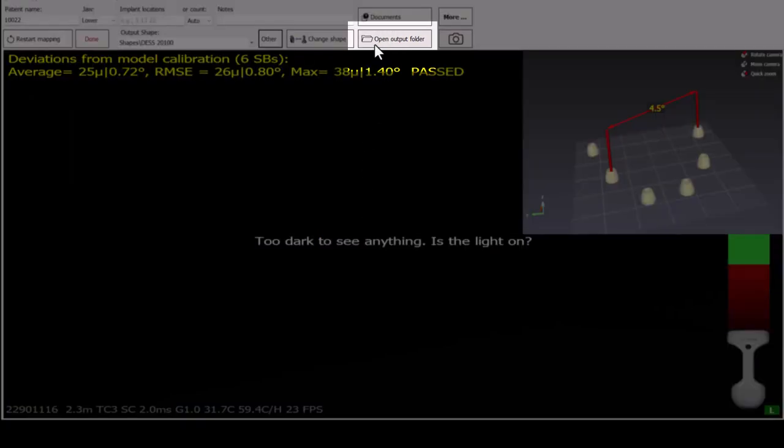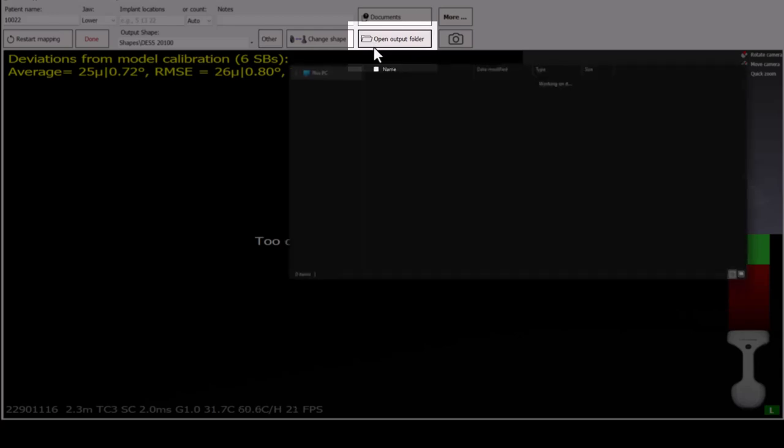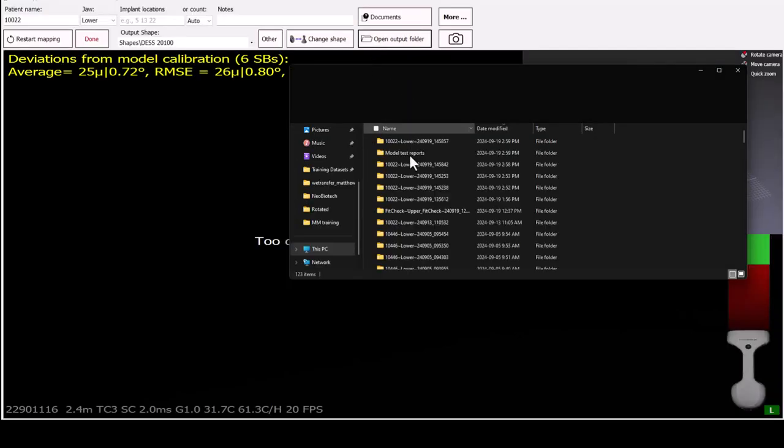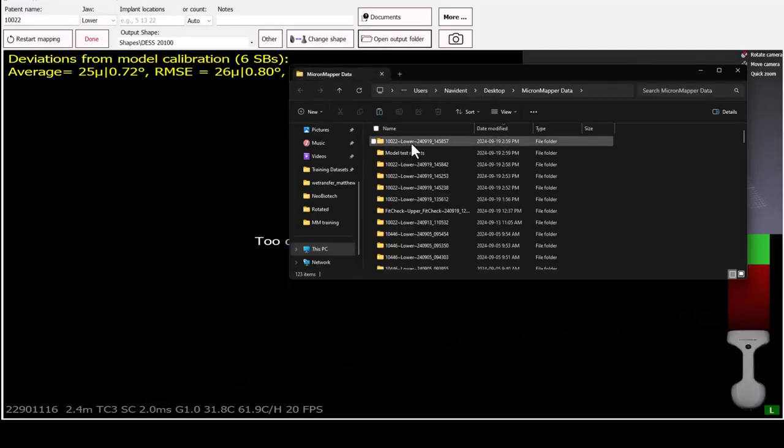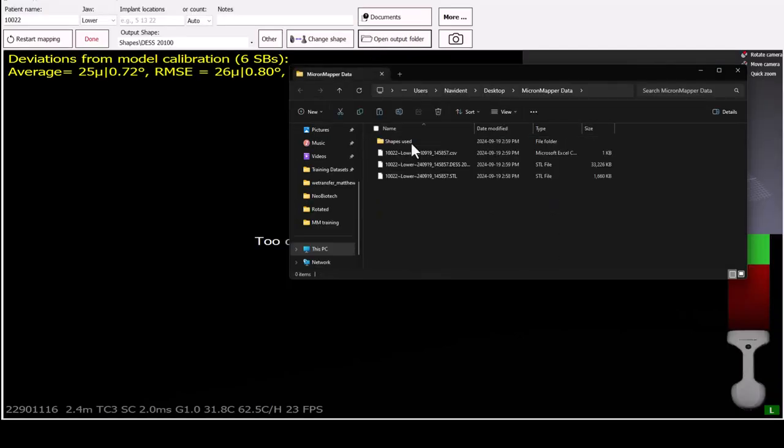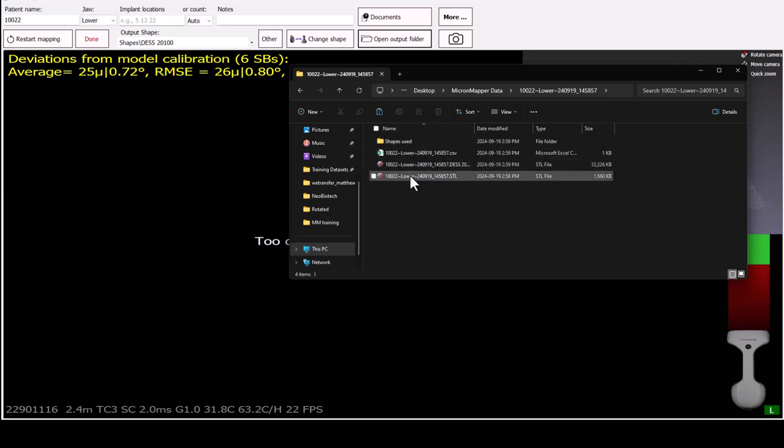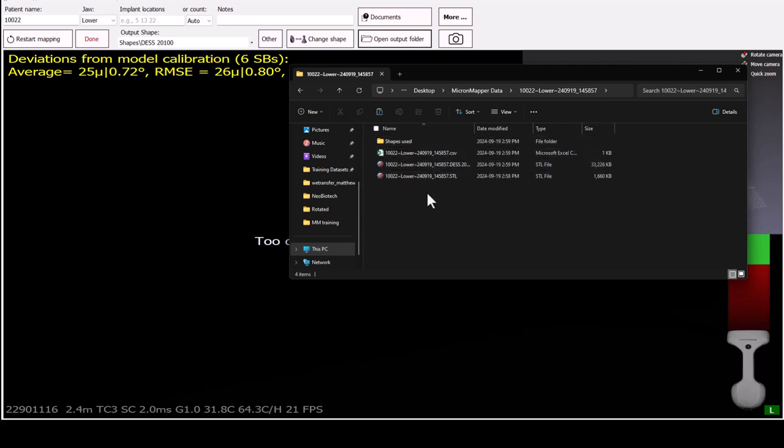You can access your scans by pressing the Open Output Folder button, which will open all of the MicronMapper data. Within one scan folder, you will find all the STL files that were saved in different shapes, as well as the CSV file that can be used to further process your data.